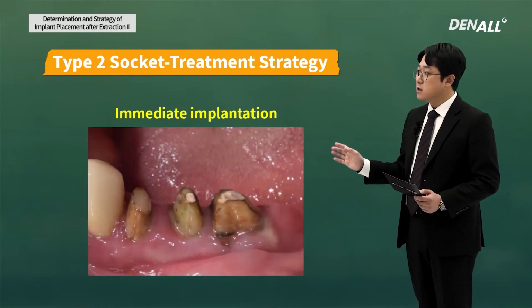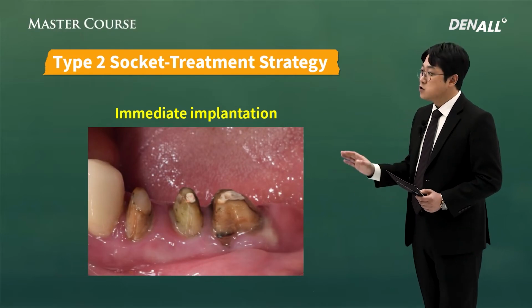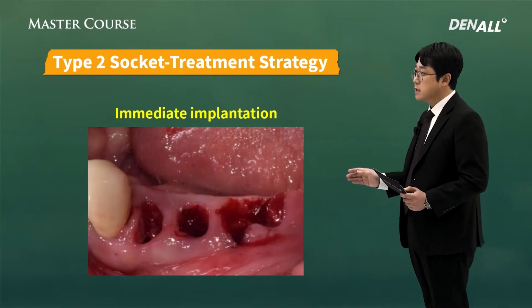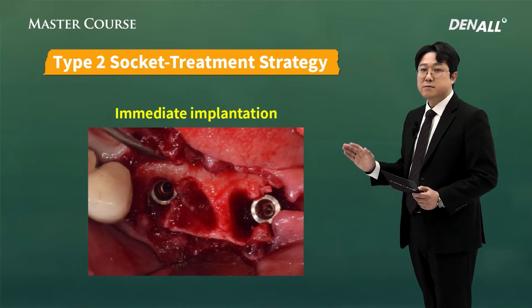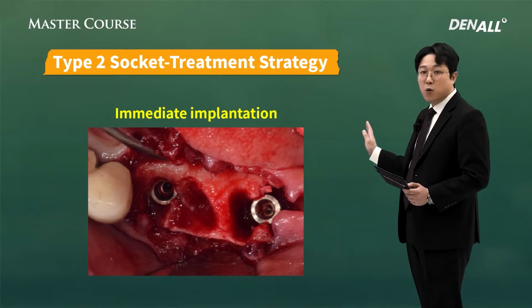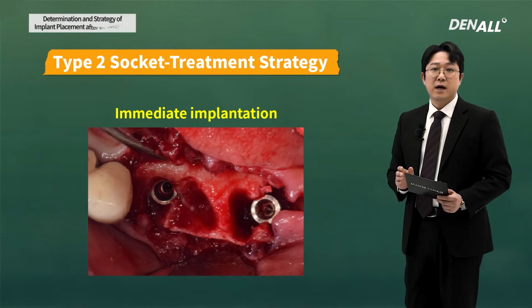After the crowns were removed, this is the patient's mouth. There's not a lot of soft tissue resorption. This is after extraction. After implant placement, in number 34 and 35, there is buccal bone loss, and in number 36, there is distal resorption.